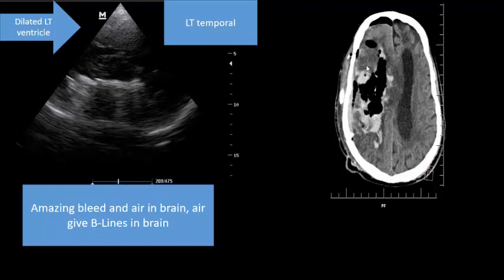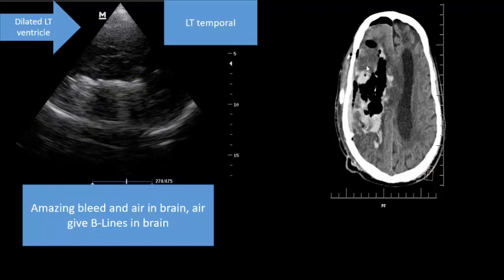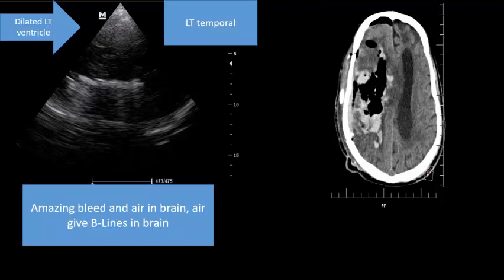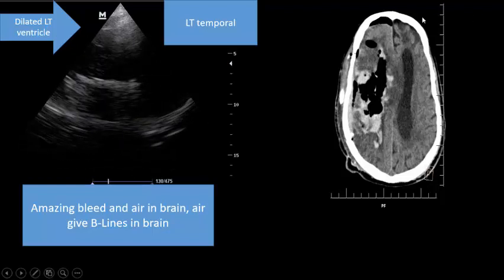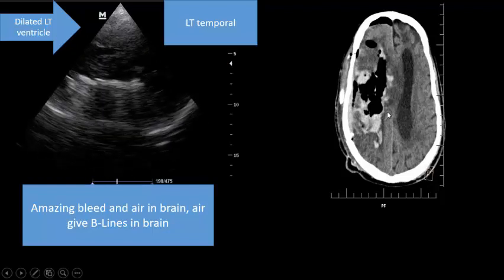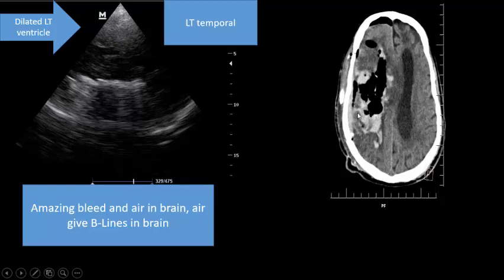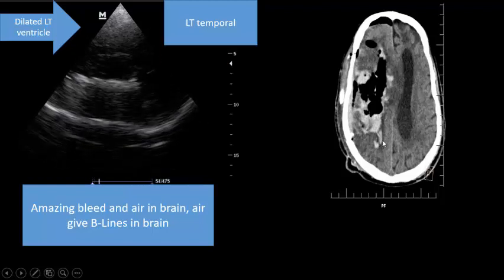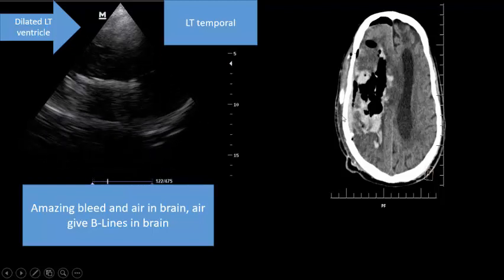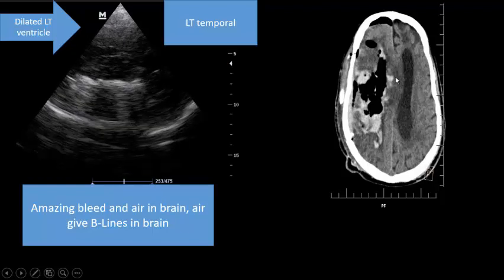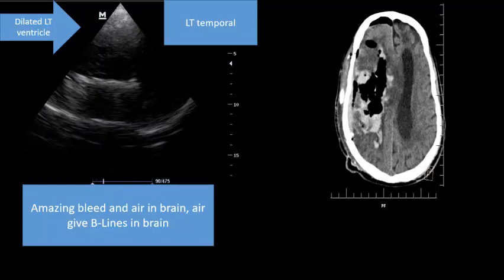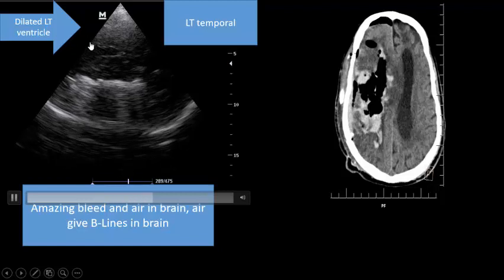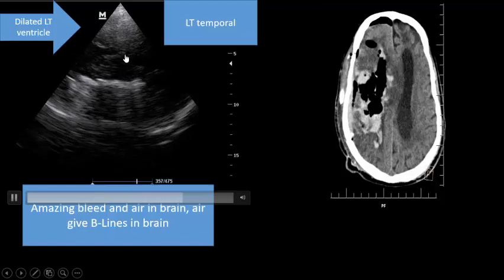Hello everybody, welcome back. I'm so happy to meet you again in this short video — an amazing case: post-operative craniotomy. The case involves massive bleed from the right temporal area, right cerebral cortex. We did TCCD post-operatively, which revealed a dilated lateral ventricle.